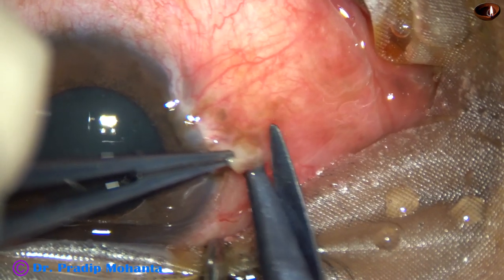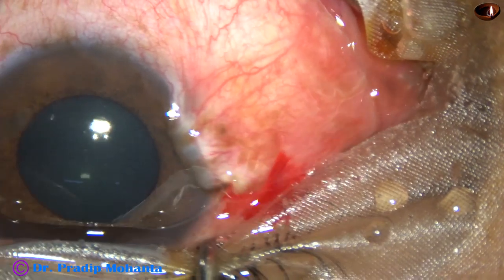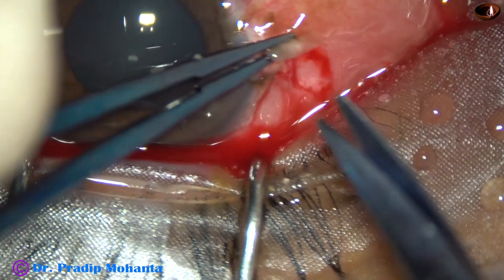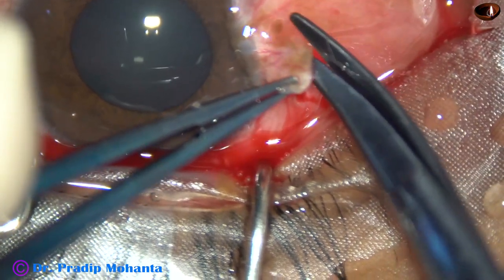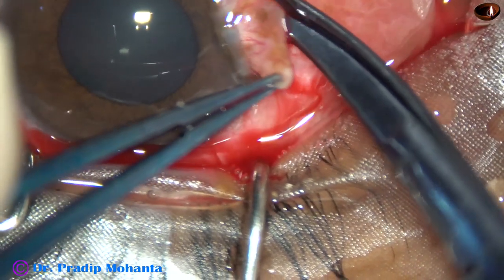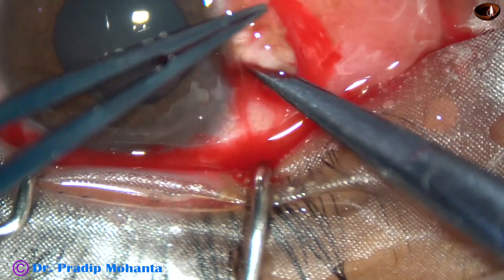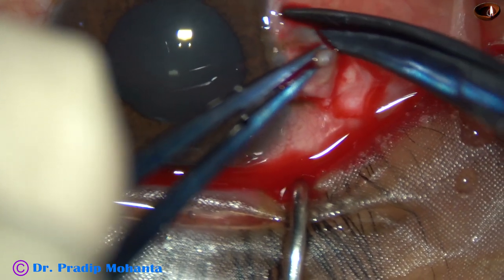We can see the conjunctiva is not healthy in this case. So I decided not to use this conjunctiva as the graft tissue. I am going to sacrifice this conjunctiva and take fresh conjunctiva from the supero-temporal aspect and place that fresh conjunctiva as autograft.